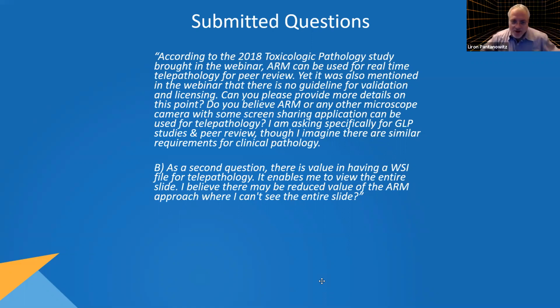Yeah, a similar thing, Gabe, to clinical practice: if you need to use telepathology to support your practice, you need to pick the right technology to fit that and not overfit it with expensive, unnecessary technology. So if you have a situation where you do not have a skilled person on site and someone's just loading a slide in a box and they know nothing about pathology, fine. Then you need access to the whole slide and control of that, whether it's a whole slide imaging system or a robotic system that does telemicroscopy and you can navigate. Those are expensive to buy and expensive to maintain.